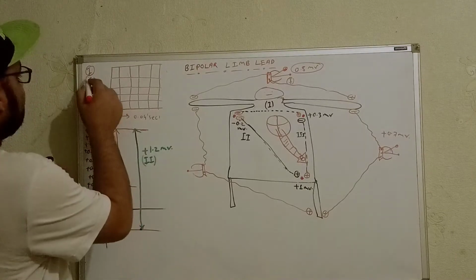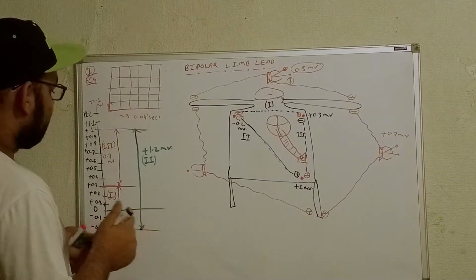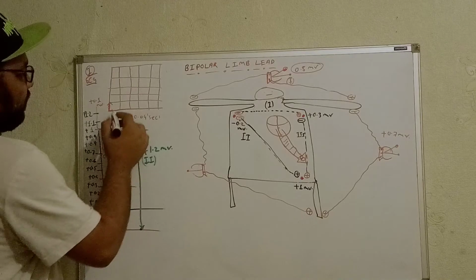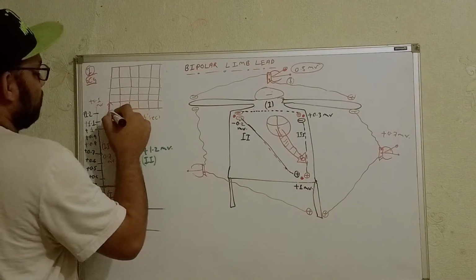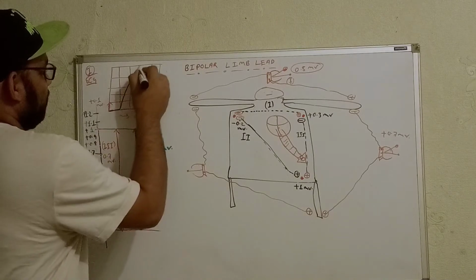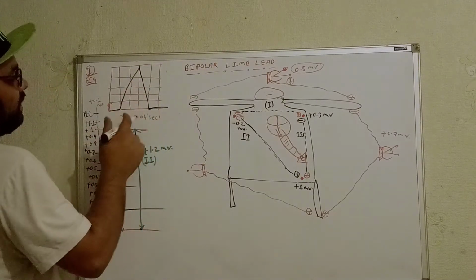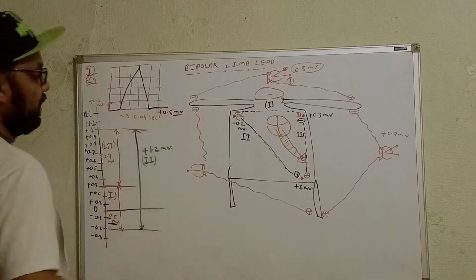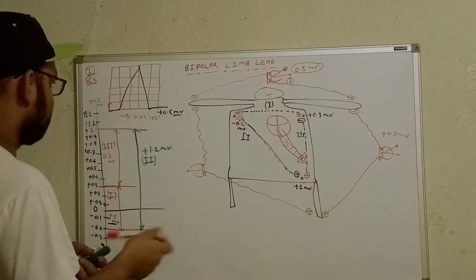Now in terms of the ECG lead number 1, whatever the potential difference we got over here, for lead number 1 we got the potential difference 0.5 millivolt. Now if you count from here, we'll get 1, 2, 3, 4, 5, just like this. So the potential difference, if I go over here, will be in this way. So for lead number 1, we will get plus 0.5 millivolt. Okay. Now for lead number 3, let's make the same thing over here.